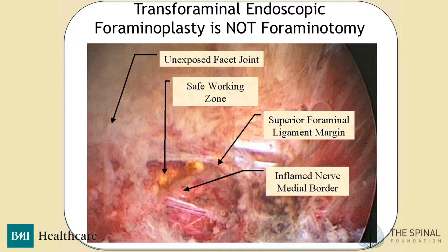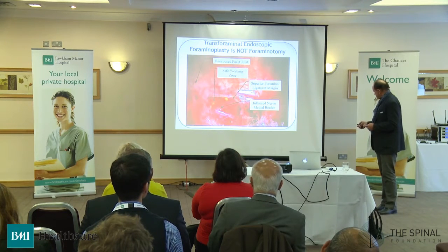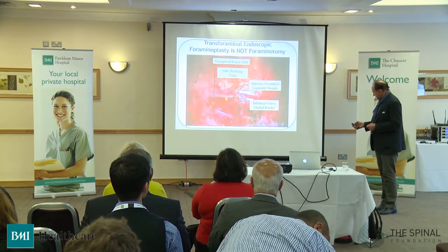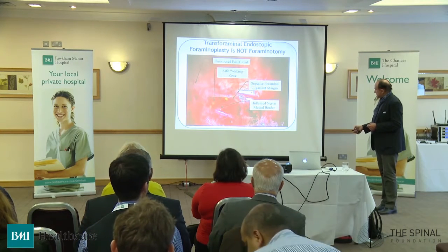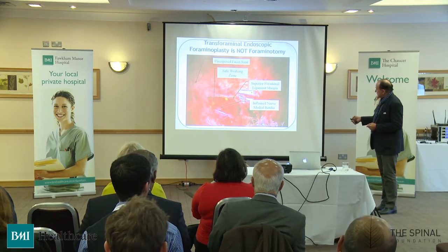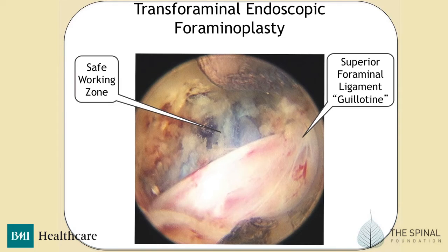And this is what you see when you get in there. It looks even worse on that screen than in real life. But the nerve is there, if I can get it to work. Okay, so the nerve is actually there and there, covered by scarring, and believe me, the facet joint is there, and the other facet and pedicle is here.